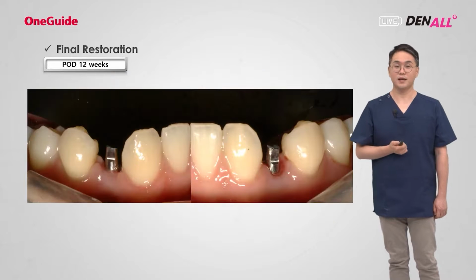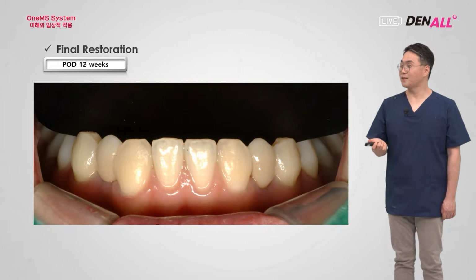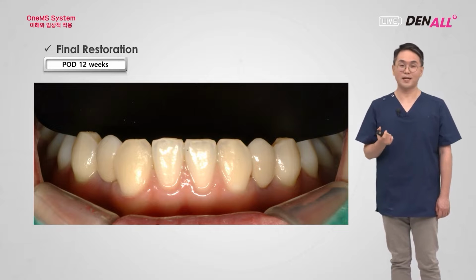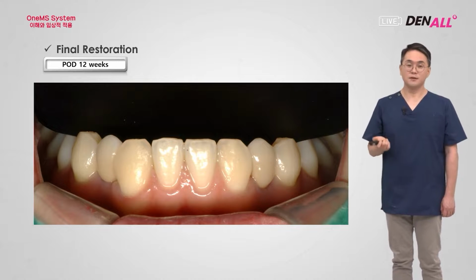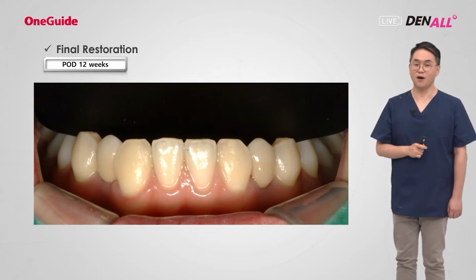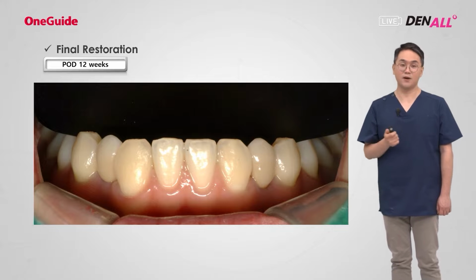I took the impression, and then the final prosthesis was delivered. Even after that, what is implant and what is natural tooth cannot be distinguished. So it's very aesthetic. If the MS implant had been placed without any support, it could have gone okay, but it might also not have been very aesthetic. Looking at these cases, again, the top-down approach is very important. Design the final crown and place the implant in the ideal area. If it's a 2-piece type, using an abutment, some compensation can be made. But for a one-body MS implant, the help from the guide is very crucial.